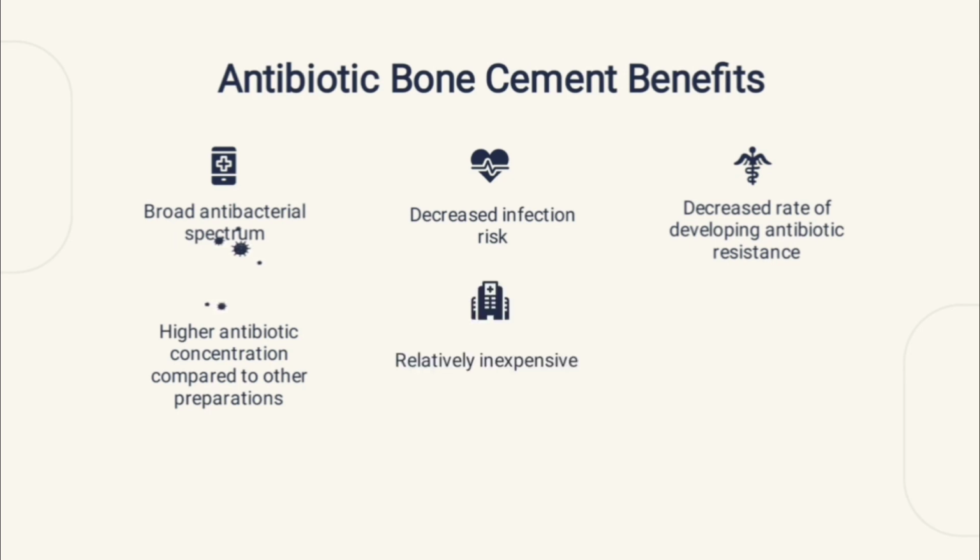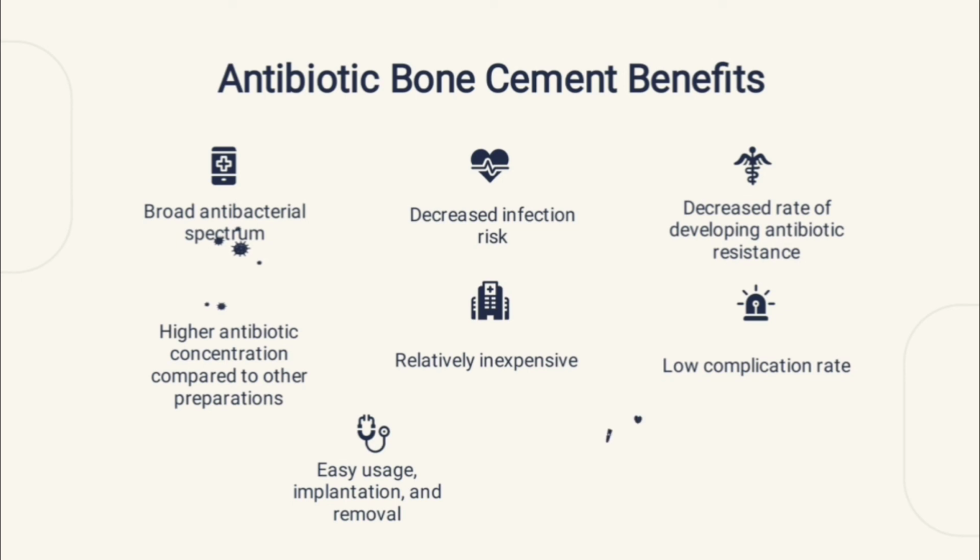It is inexpensive, has low complication rates, is easy to use, implant and remove, and has a longer period of minimum inhibitory concentration.